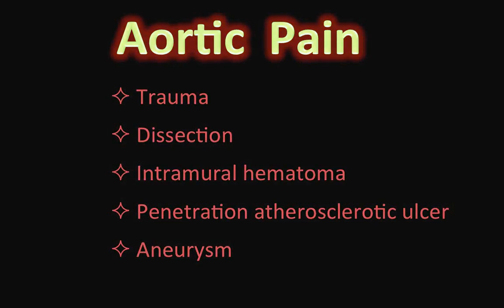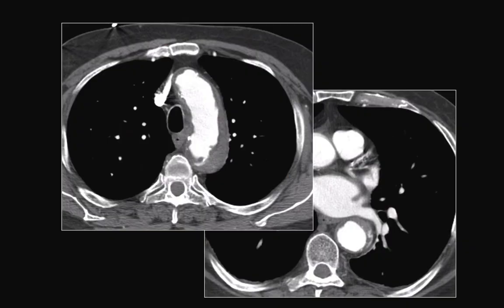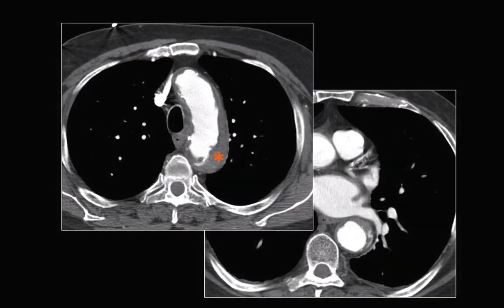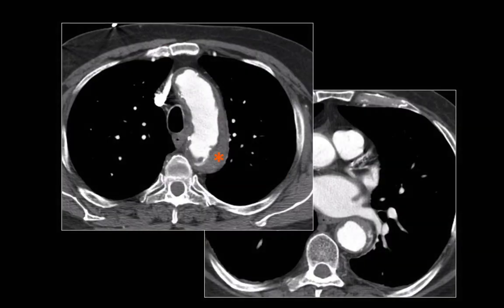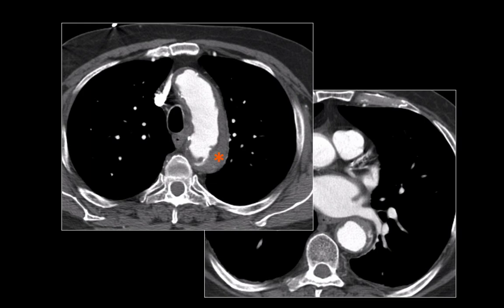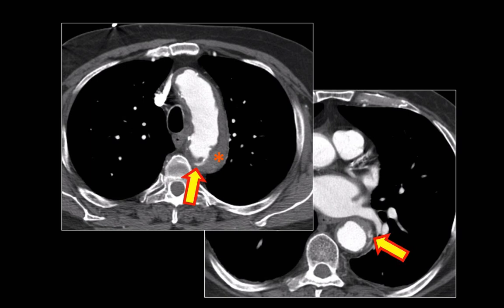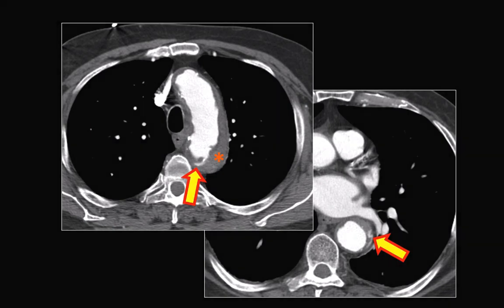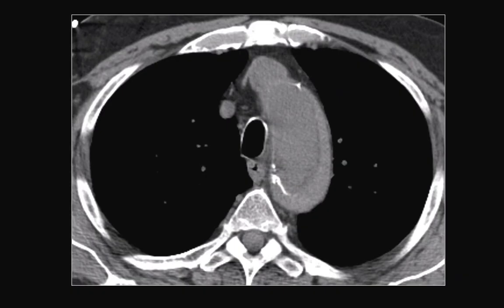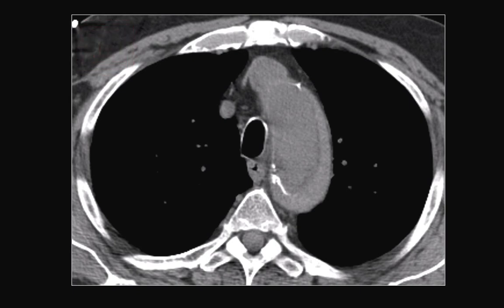Fusiform or saccular aortic aneurysms may be complicated by dissection or rupture, and could be a serious cause of morbidity and mortality. Let's look at our case again. You've probably noticed that the patient has a thick hypodense peripheral rim. This rim shows an internal area of linear and irregular contrast density. Here's an additional image to look at and think about.